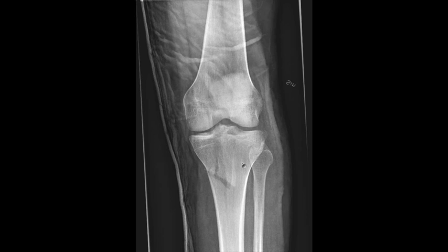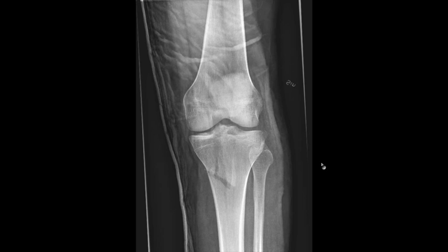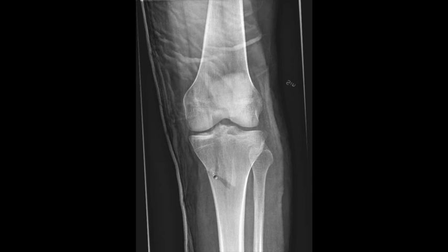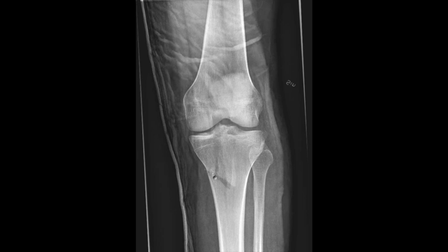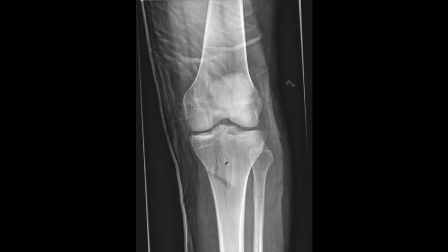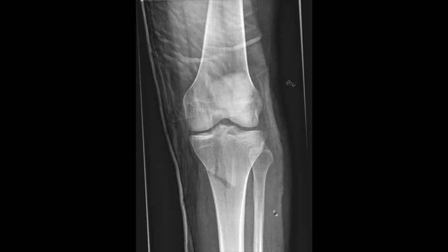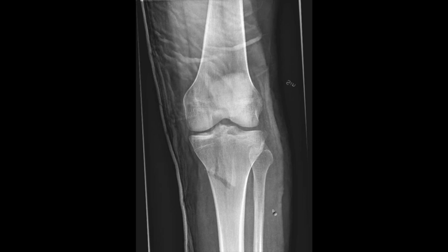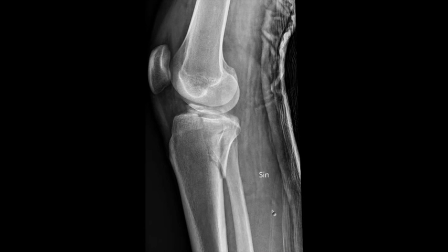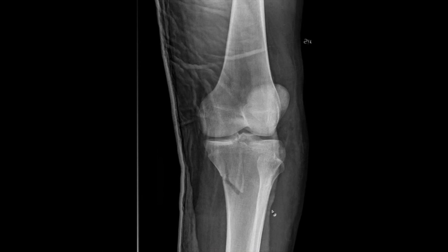First case: a patient with a knee injury to the lower knee. It's very obvious — there is something strange happening here. That's a big fracture to the tibia, just below the medial condyle. He already has a cast on him, so the clinicians already knew there was a fracture without even having an X-ray. Let's always check the other projections to be safe — and yes, it looks horrible.